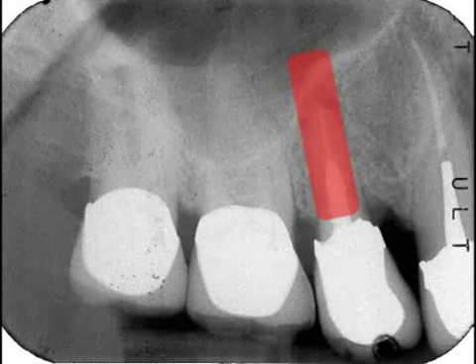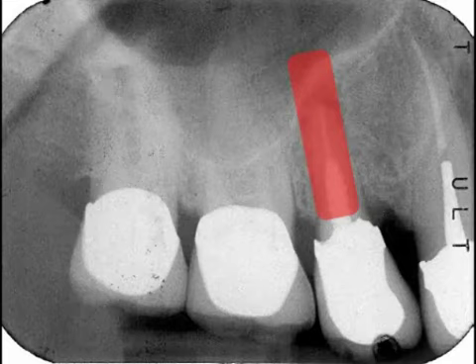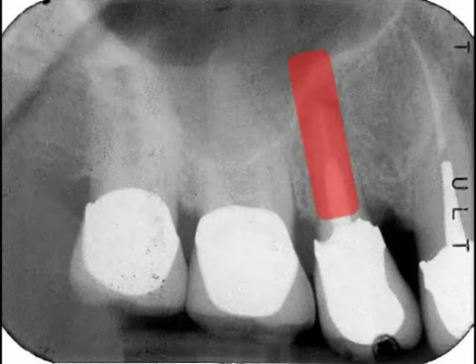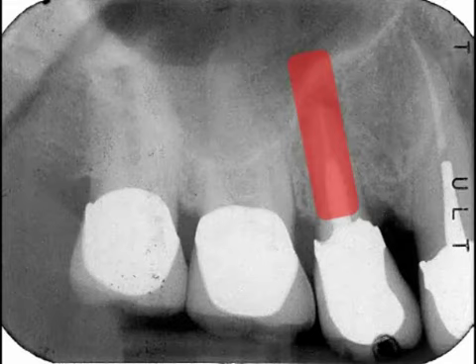Normally with a premolar site, I'm going to use about a 4 millimeter diameter implant that's 13 millimeters in length. That seems to be kind of the average for this site. And if we take a look at a projection of where the implant is going to go, what we see here is that the root is angled so that it's much closer to tooth number 3 than it is to tooth number 5, and that with a 13 millimeter implant it would most likely penetrate the floor of the sinus, and so we'd have a perforation into the sinus cavity.